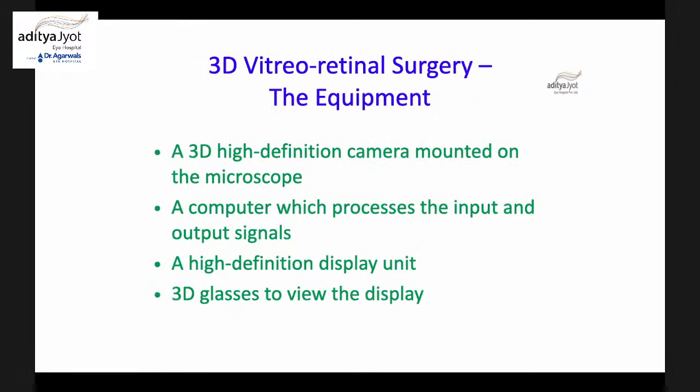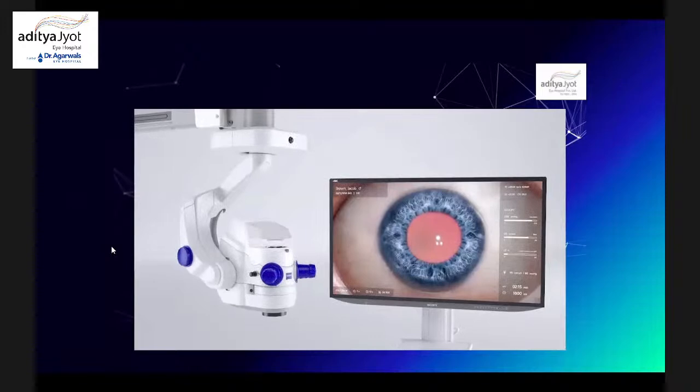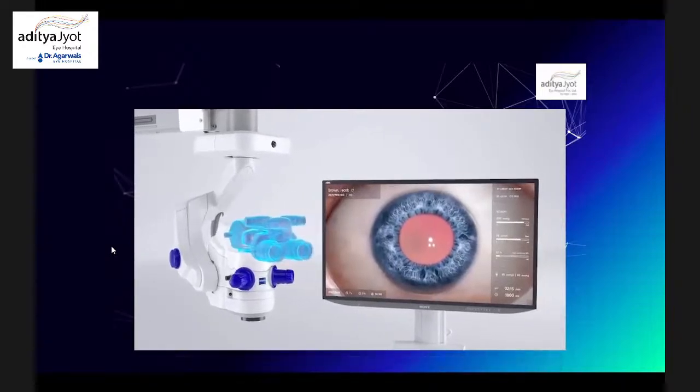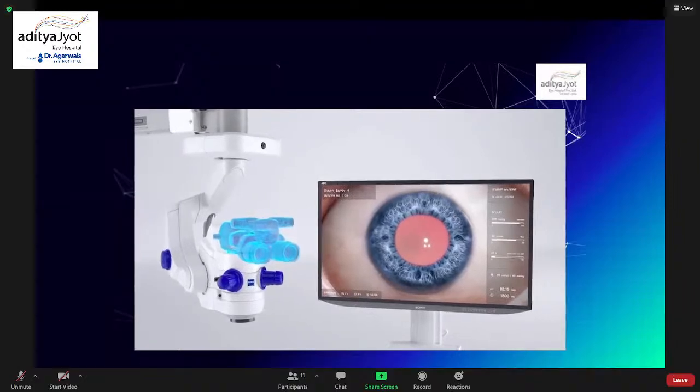I'm glad Dr. Deepak Mishra mentioned you are getting 3D vitreoretinal surgery here in 2 OTs, a computer which processes the input and output signals, and then a high definition display image, 3D glasses to view the display, and this is how the display is done. So you can also have the 3D viewing system and the mechanics, and that's the best part.